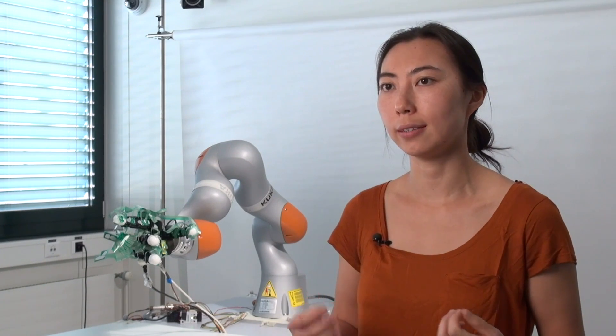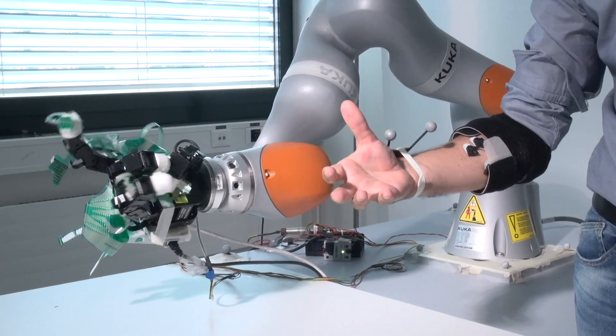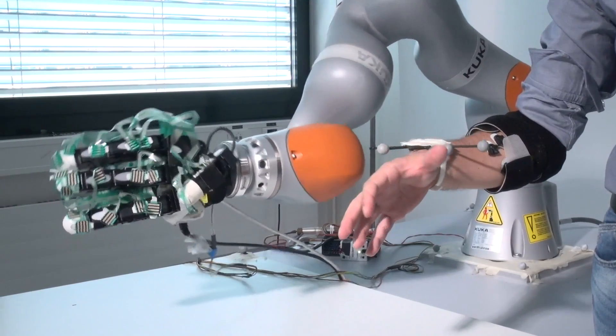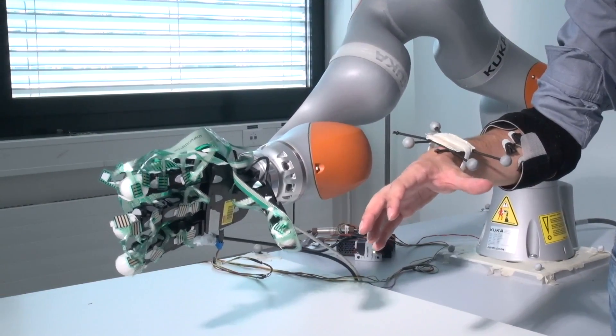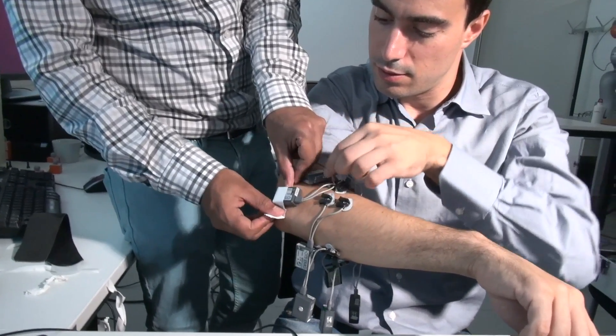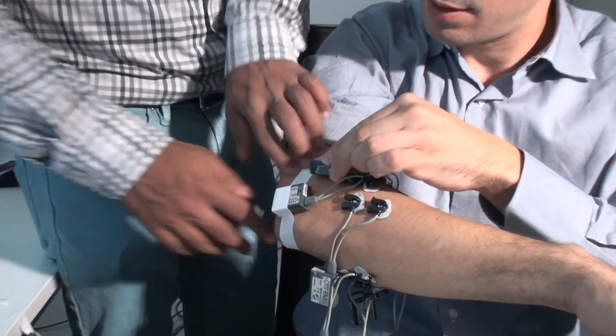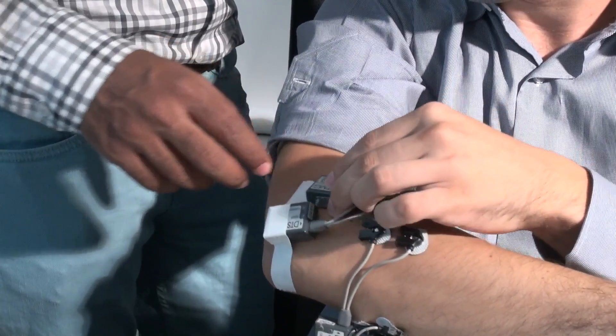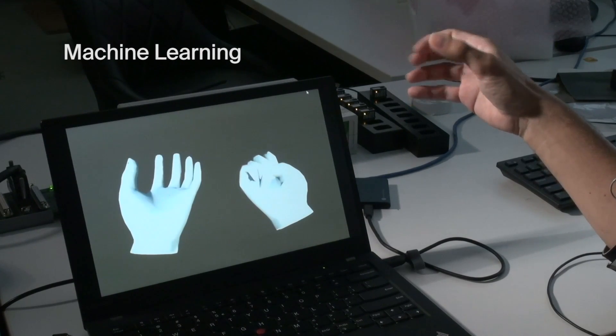For an amputee, it's actually very hard to contract their muscles many different ways to control all of the ways that our fingers move. So what we do is we put these sensors on their remaining stump and then record them and try to interpret what the movement signals are.